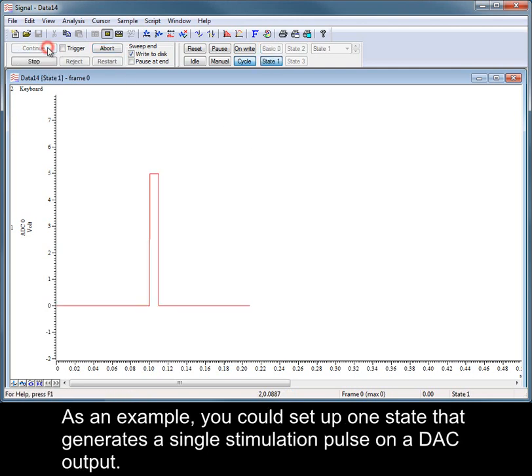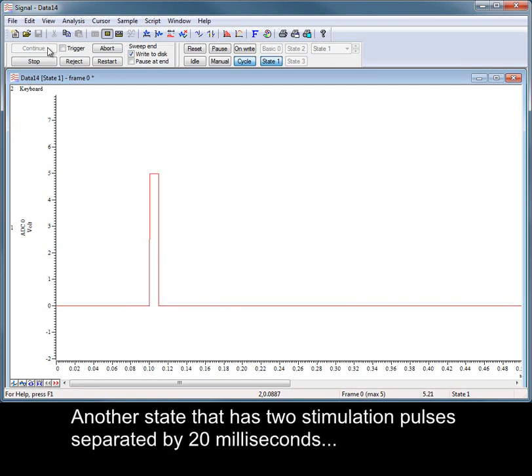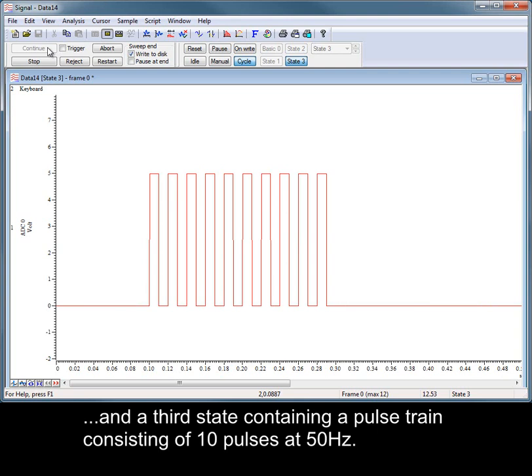As an example, you could set up one state that generates a single stimulation pulse on a DAC output, another state that has two stimulation pulses separated by 20 ms, and a third state containing a pulse train consisting of 10 pulses at 50 Hz.